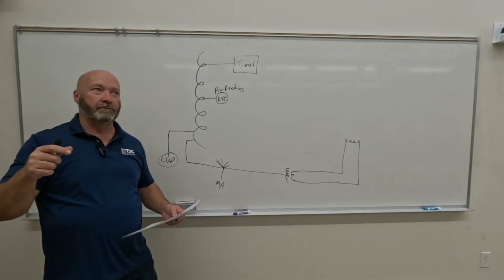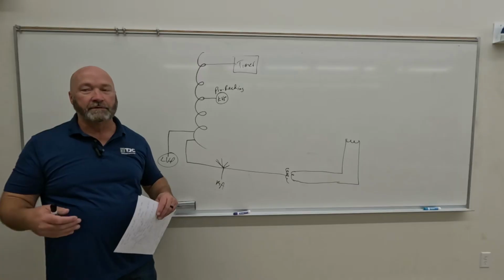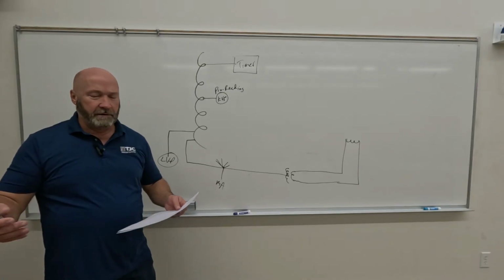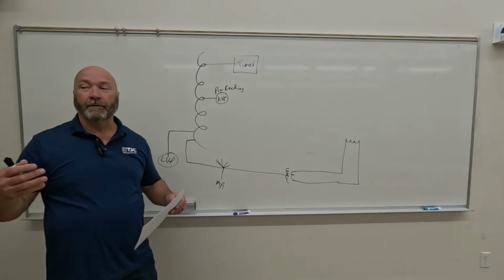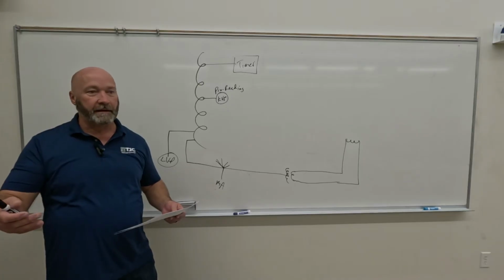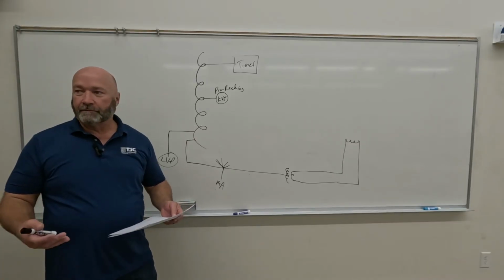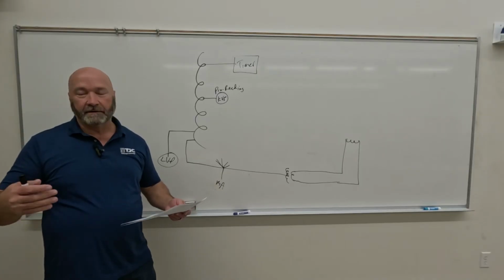Okay, so how do you set your timers? How do you set mAs on single phase machines? You adjust your mA, you adjust your kVp, and time, exposure time, right? So how do you adjust your time on three-phase equipment with an electronic timer? You adjust your kVp, you adjust your mA, and you adjust your time, right? So on mAs timers, how do you adjust it? You just push the mAs button and it adjusts your time.